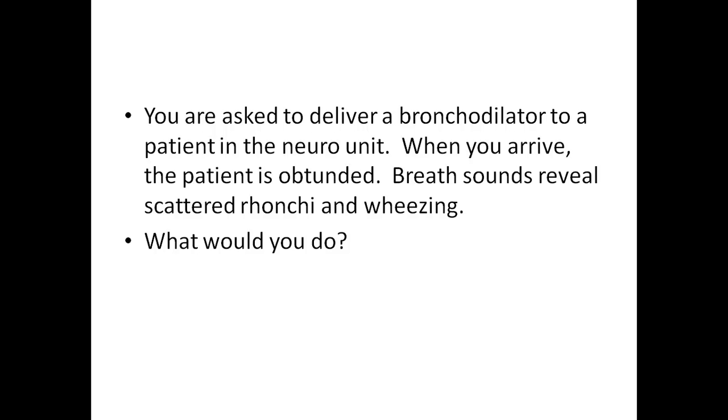So now we're asked to deliver a bronchodilator to a patient in the neuro unit. When you arrive, the patient's obtunded. Breath sounds reveal scattered rhonchi and wheezing. What should we do?